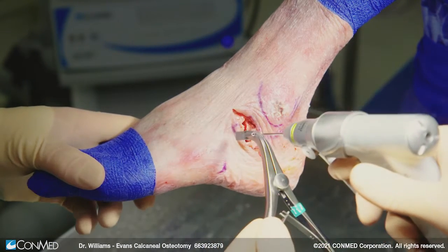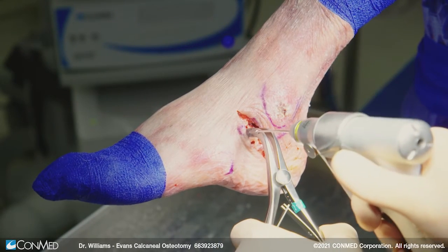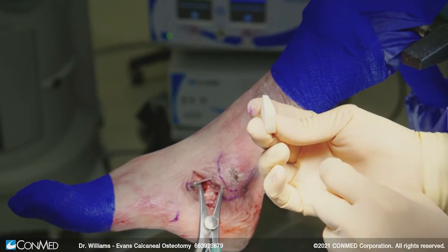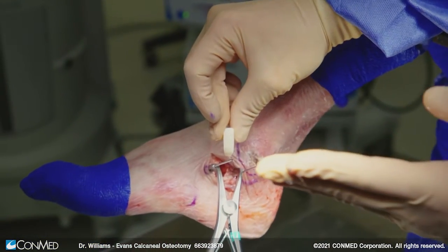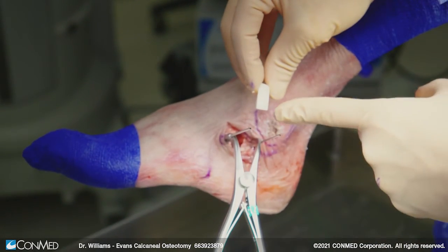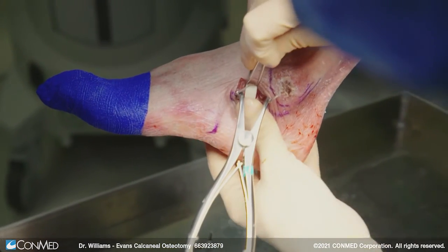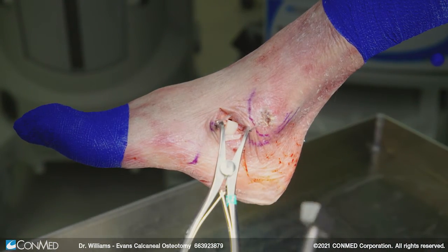Use whatever joint retractor you prefer, and then we're simply going to drive it in. The reason this is helpful is that it will help you from fragmenting your graft when you stick it in. My preference is MTF — I really think they've got the best track record in terms of graft harvesting. It's a trapezoidal graft, not a triangular graft. One of the advantages of doing it this way is that your peroneal tendons run right across the side of that graft site, and if you have a very rough edge and place it in like this, that rough edge sometimes abrades and bothers the peroneal tendons. So in many instances I will orient it to open it up, and I should be able to drop this in. We've sized this out for an eight millimeter graft. You don't want this thing to sit very proud — use the tamp to put it in or you'll crush your graft.